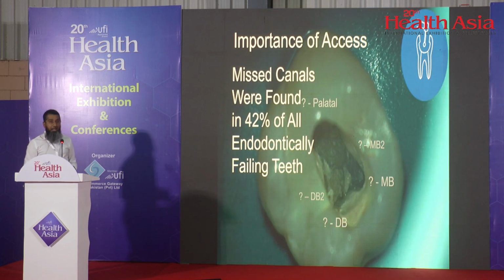Okay. Access, it's mostly said access leads to success. So if you have a good access opening, you can visualize all the canals, you can locate all the canals easily. And once you have located the canal, then comes your step of your cleaning and shaping. So access is very important. Like here you can see in a study which quoted that if your access is not done properly, maybe you can miss up to 42% of canals in cases, which can be a major cause of root canal failure.